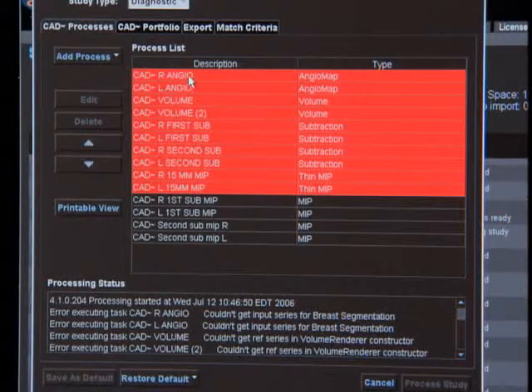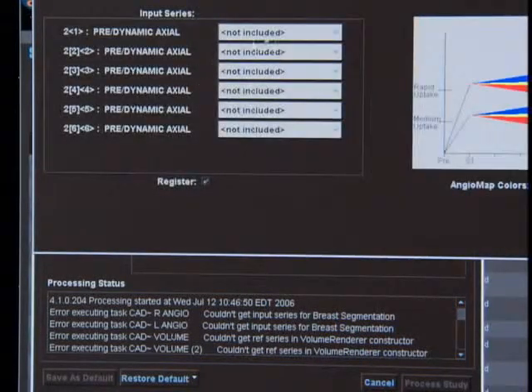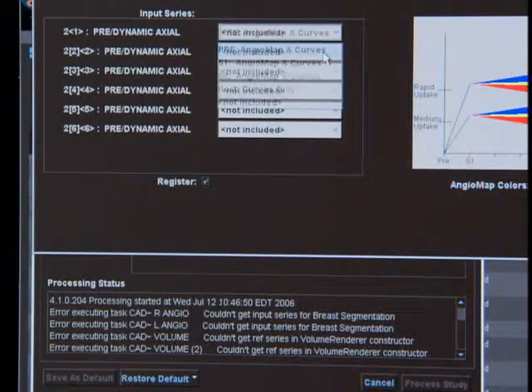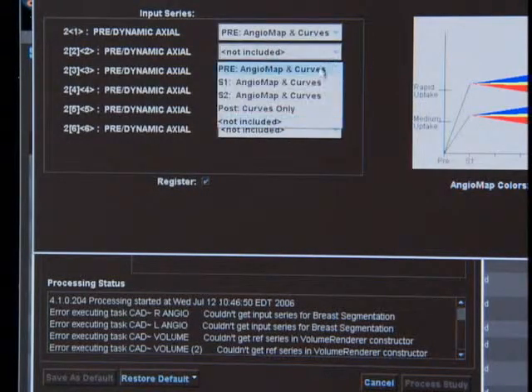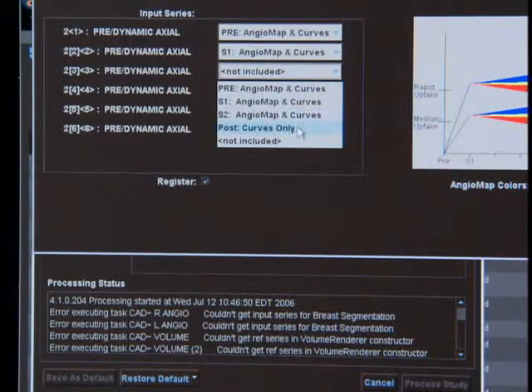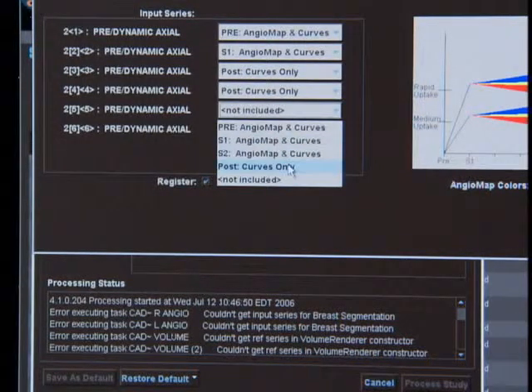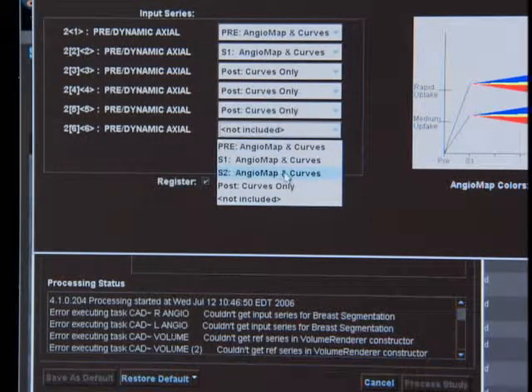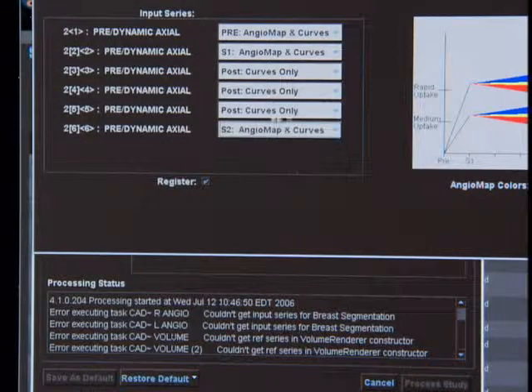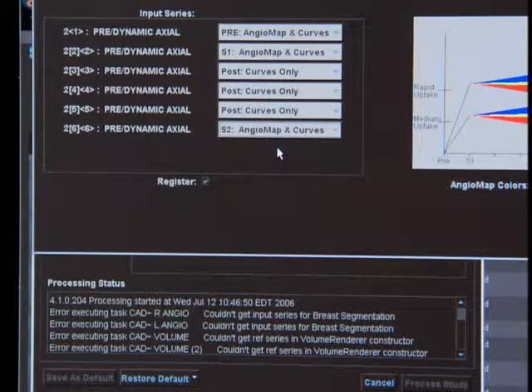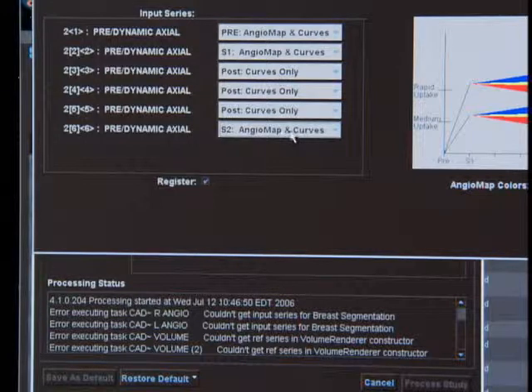As you become more familiar with CatStream, you may be able to actually go in and edit these hanging protocols and therefore get your system to process the study without any further delay. This is something that comes just with experience as you work with your application specialist and become more familiar with setting up the processing features of your CatStream.